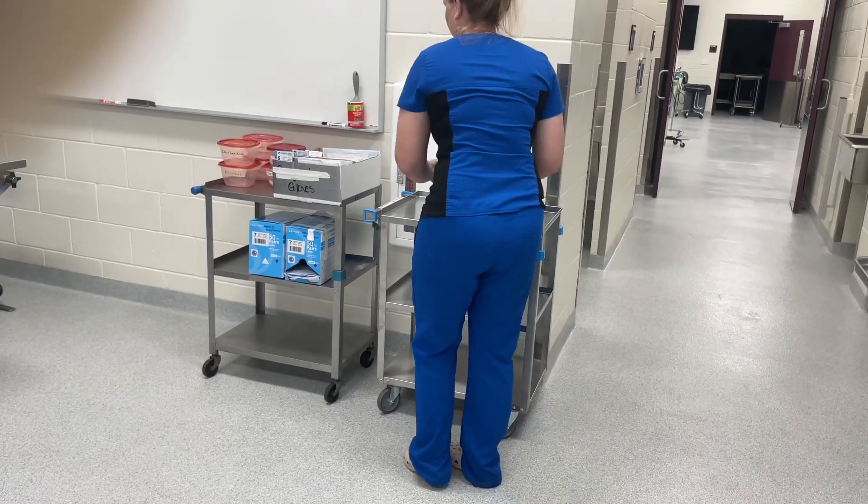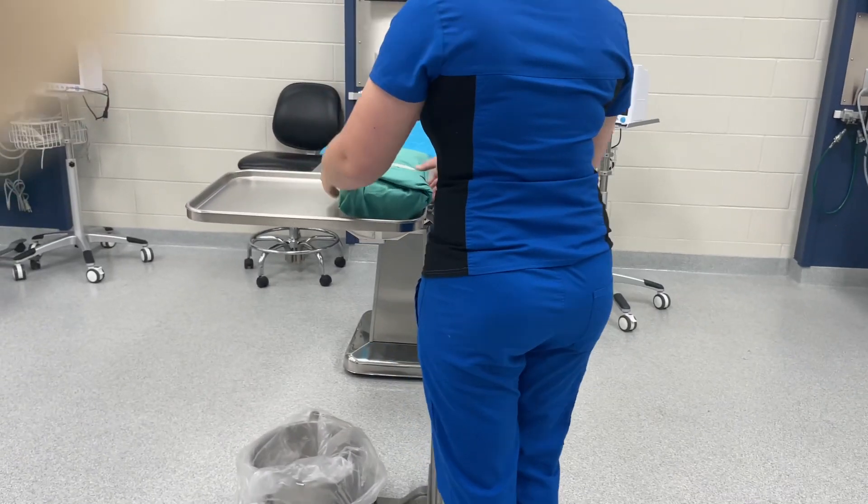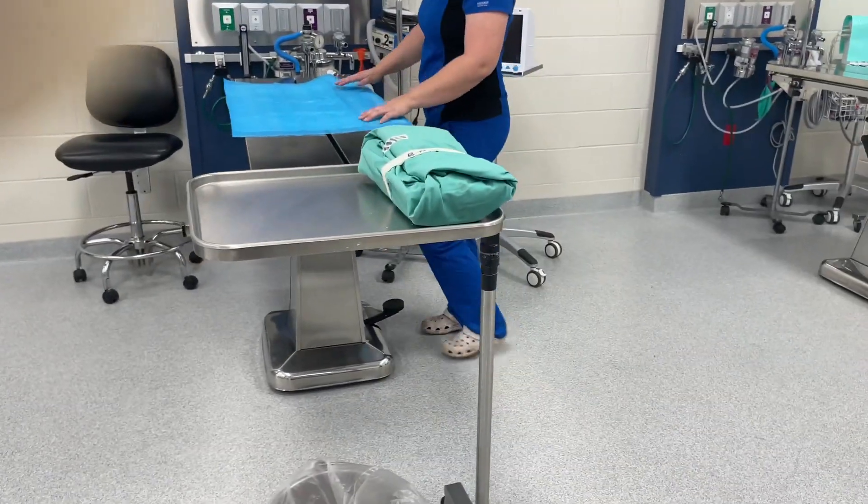Before anesthetizing your patient, make sure to set up your table. Grab your surgery pack and place it on the Mayo stand, and we're going to adjust our table height.